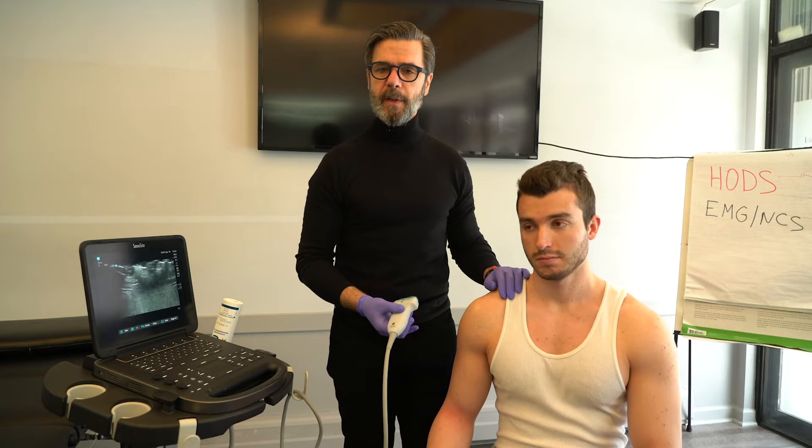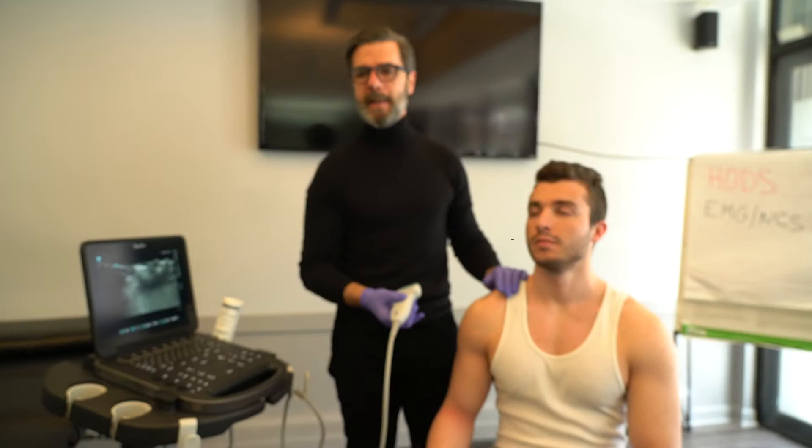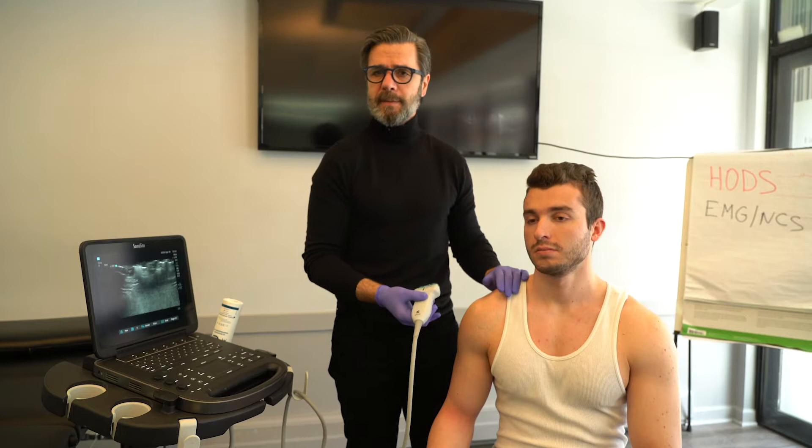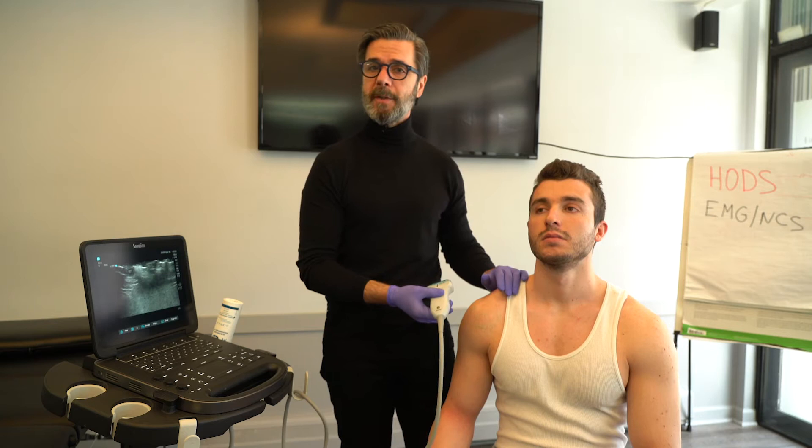Musculoskeletal ultrasound has been around for a while, but it's a fairly new tool for physical therapists. I've been doing MSK ultrasound for the past six, seven years now, and we have been implementing it in our facility. During my initial evaluation, I perform the ultrasound just to get a better idea of what's going on with my patients.